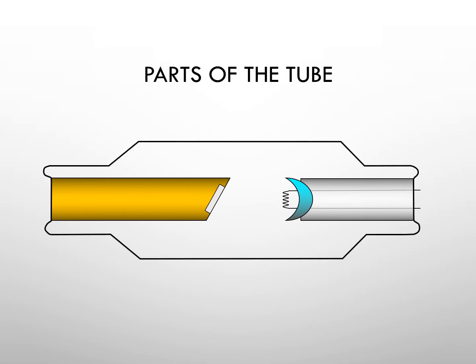The anode and cathode assemblies are contained and supported within a glass envelope. Glass is rigid and holds the anode and cathode assemblies in strict alignment, and electrically insulates the cathode and anode from each other. Additionally, the glass envelope maintains a vacuum that prevents the cathode from burning. For something to burn, it requires oxygen.